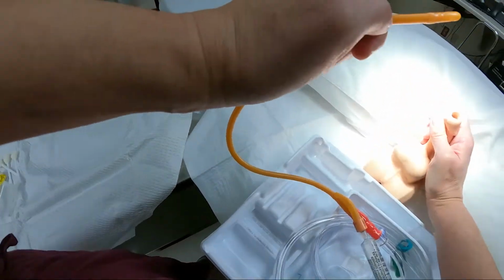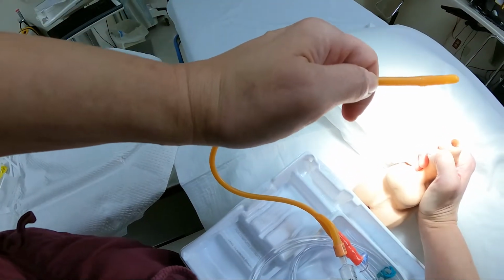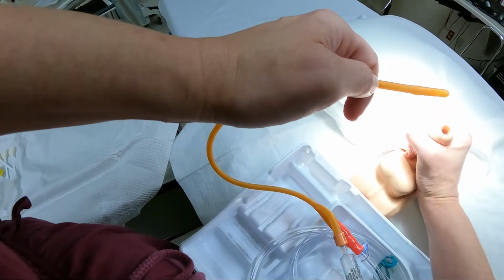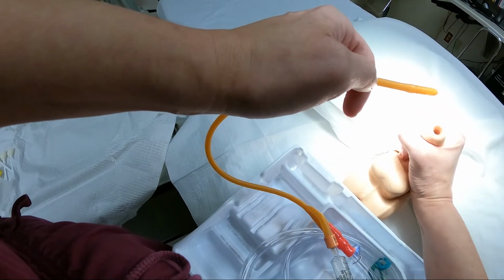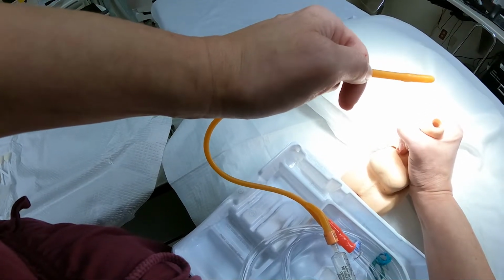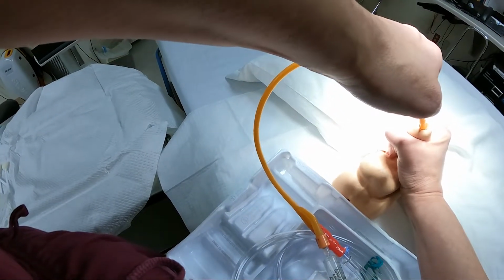Now, with men especially, and this is easier when you actually have a whole person and not just a part, you may have to do a little bit of gentle traction by holding your, you get the point. You don't want to squeeze the life out of the sucker. You just want to have gentle traction, which helps get your urethra straight through your prostate. Then you're going to go put that in there.